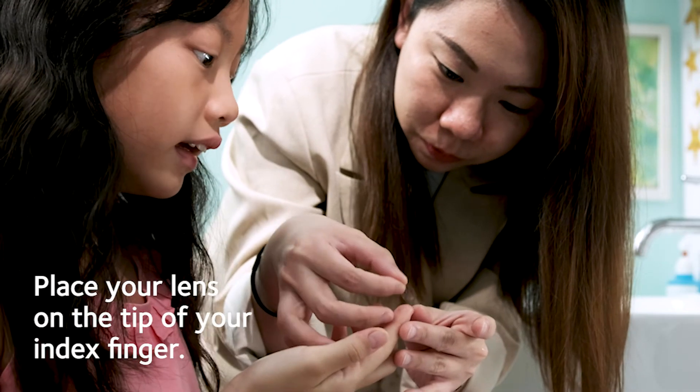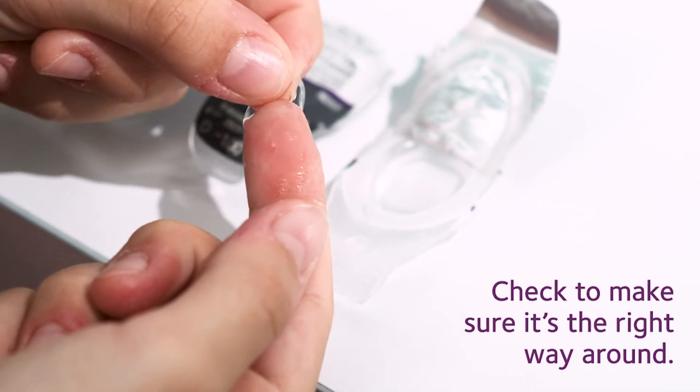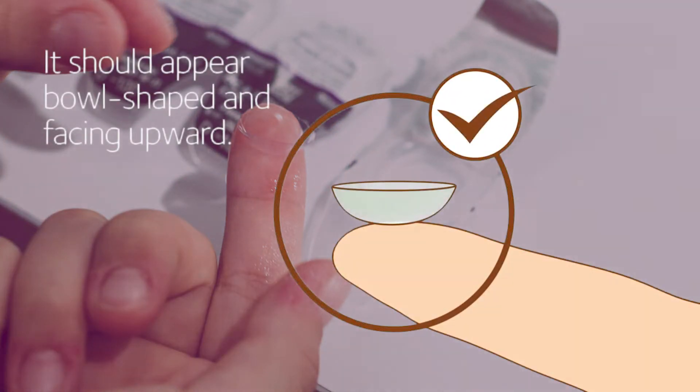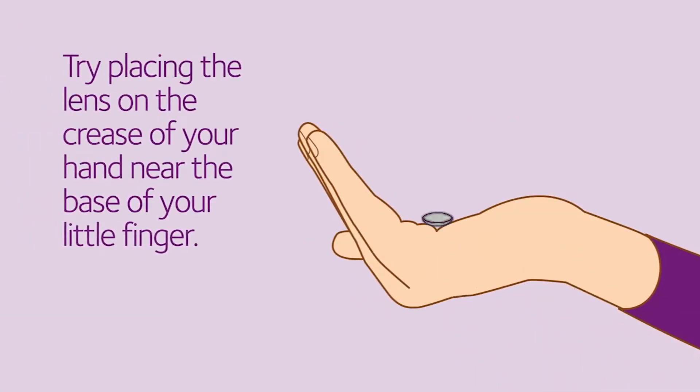Place your lens on the very tip of your index finger. Take a look at the lens to make sure it's the right way around — it should look like a bowl sitting on the tip of your finger, facing upward. If you're unsure, try placing the lens on the crease of your hand.